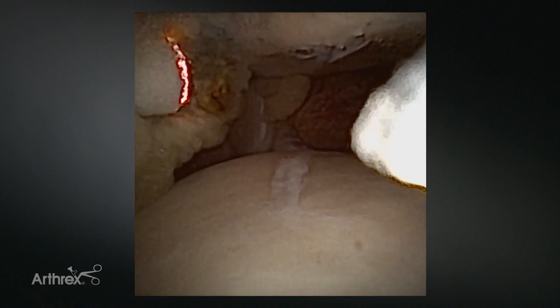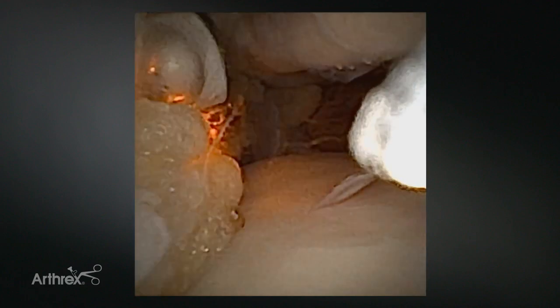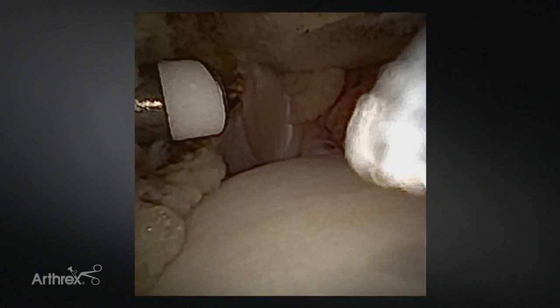Looking at the SJ intraoperatively inside the joint, we can see it's able to take small pieces and use the side cutting while cauterizing, without endangering the articular surface or vital tissues, allowing really nice visualization in a safe, controlled manner with very few bubbles. The SJ ablator also has optimized suction — the only one with this feature — allowing complete evacuation of fluid, temperature regulation, and optimal viewing.